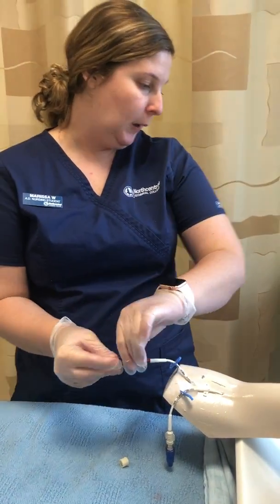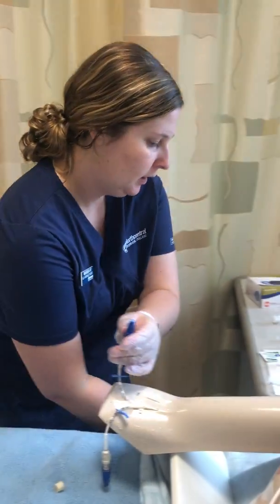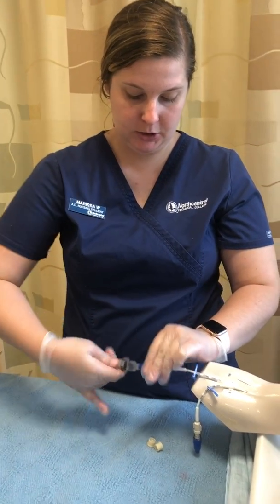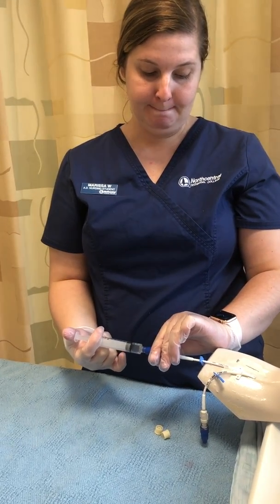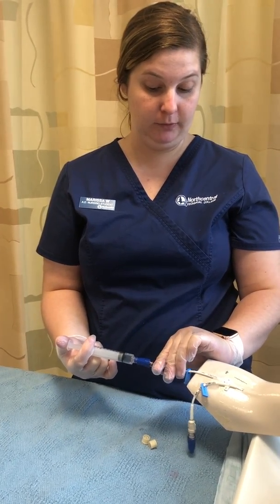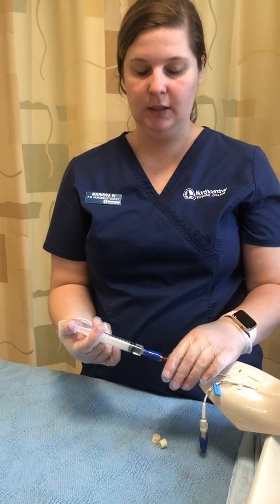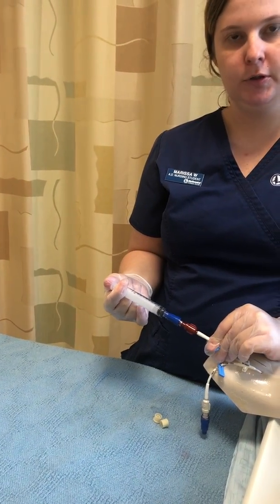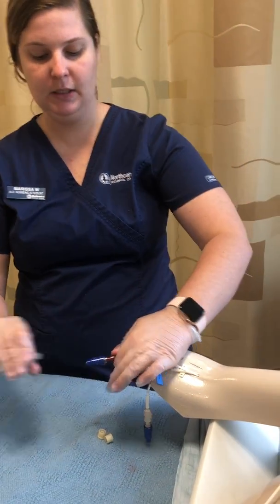And again, looking in the book and doing my math, it should be given over 2.5 minutes. So when I'm doing this, I'm going to be looking at my watch and making sure that I'm giving it over the 2.5 minutes. I'm going to unclamp it first and then make sure I'm giving it over the 2.5 minutes. And then say the 2.5 minutes is done and all my medication is in. Then I'm going to go ahead and reclamp, and I'm going to disconnect this.